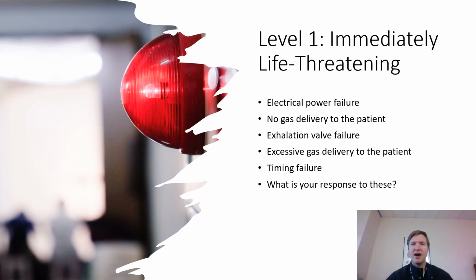So inspiratory time more than half of the total cycle time will usually cause an alarm when we're talking about the timing failure. So it'll try to end the inspiration if it's more than half of the total cycle time, so that way the patient is allowed to exhale. So the whole thing here is, if you see that timing failure, that could be a sign there's a leak in the system as well. It's just not showing up.